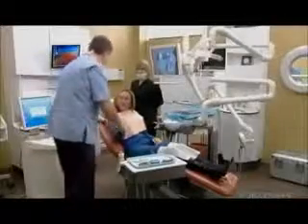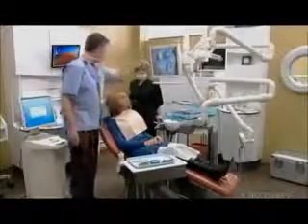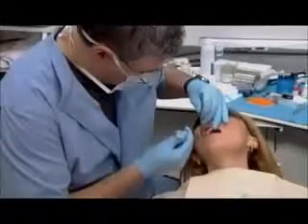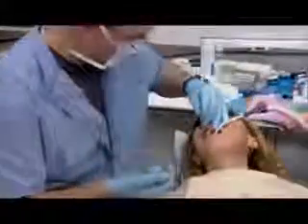The dentist meets the patient and reviews her case. They agree to replace the silver filling with a ceramic inlay, which will strengthen the tooth for much longer than a regular filling. He anesthetizes the tooth and the gums that surround it. He then stretches a rubber dam across her mouth and exposes the area to be treated through a slit. This keeps filling fragments out of the patient's mouth as he drills.